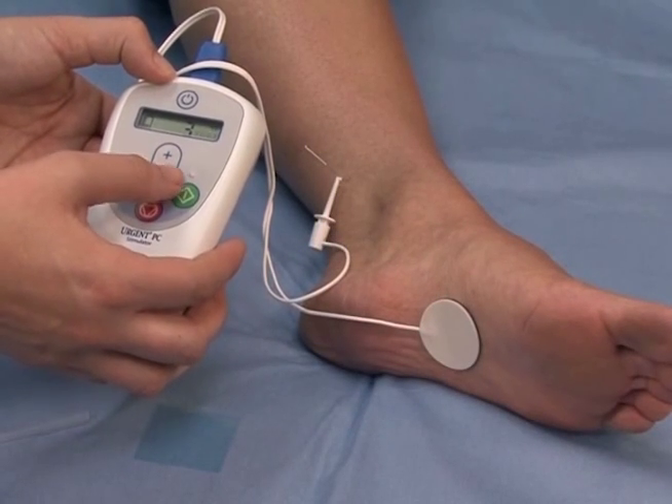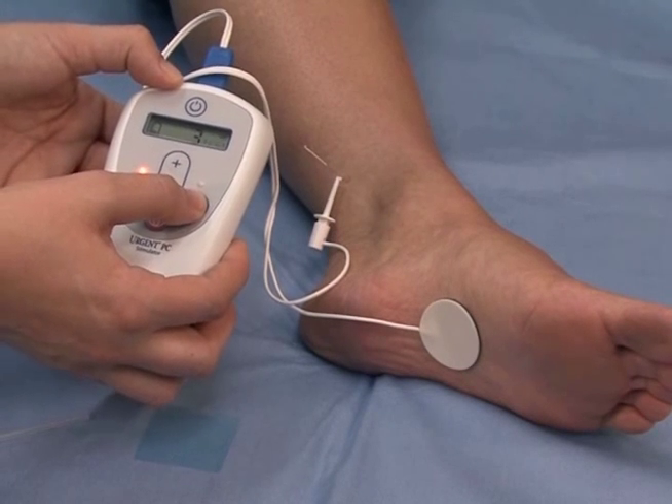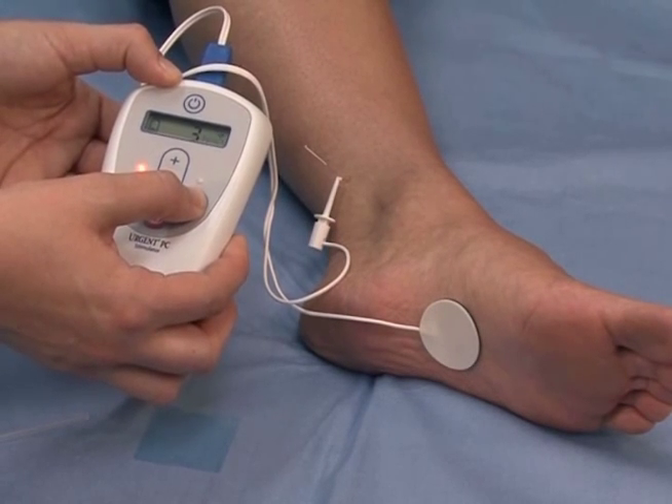The Urgent PC neuromodulation system is a low-risk, non-surgical treatment for overactive bladder.